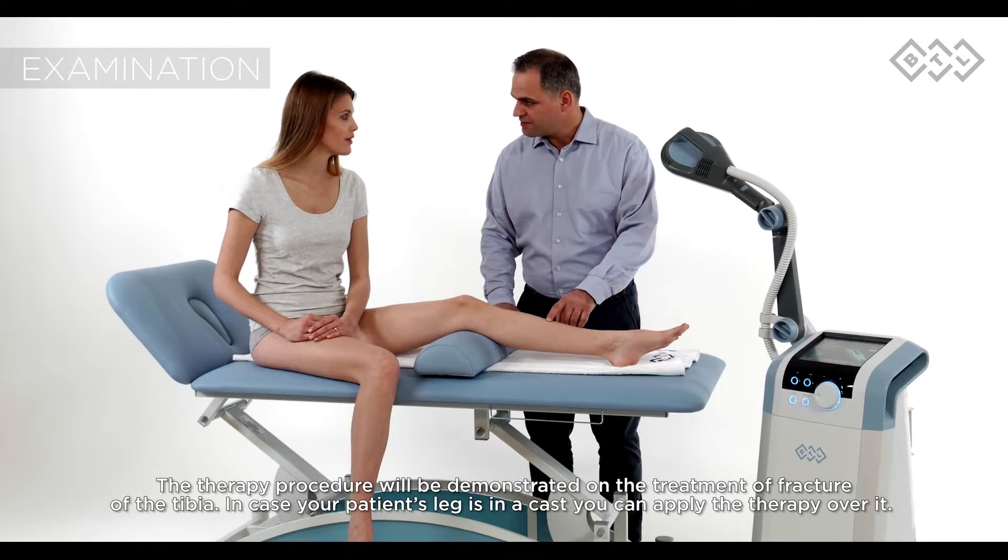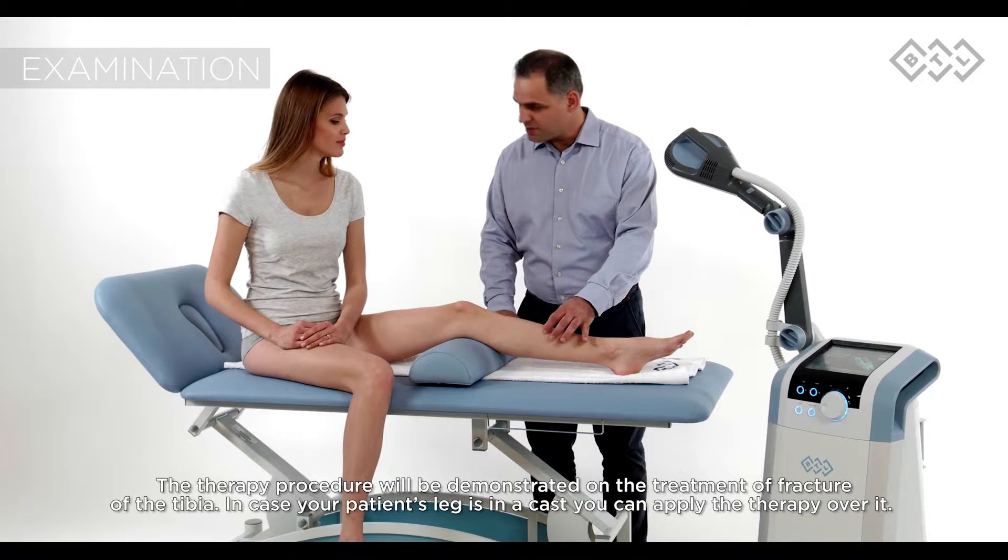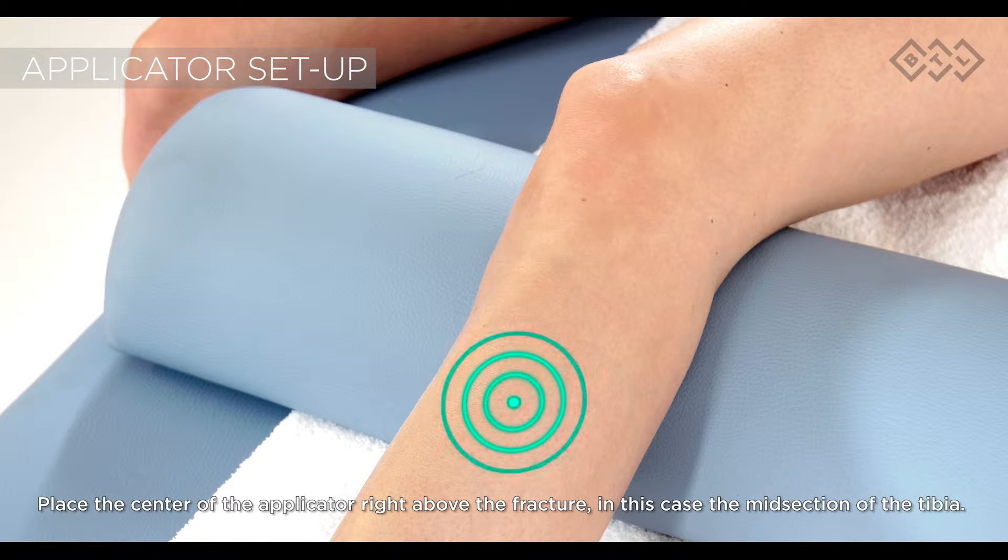In case your patient's leg is in a cast, you can apply the therapy over it. Place the center of the applicator right above the fracture, in this case the midsection of the tibia.